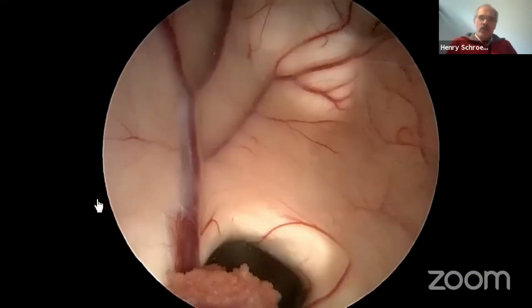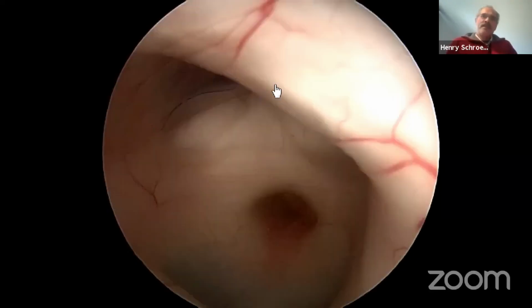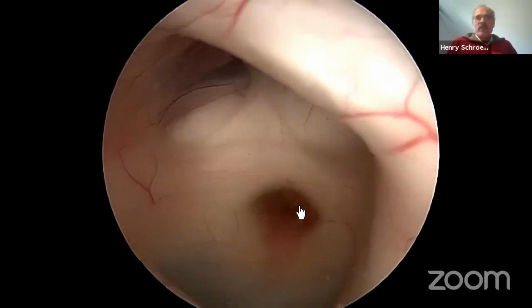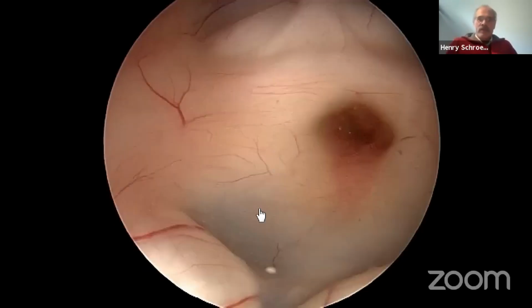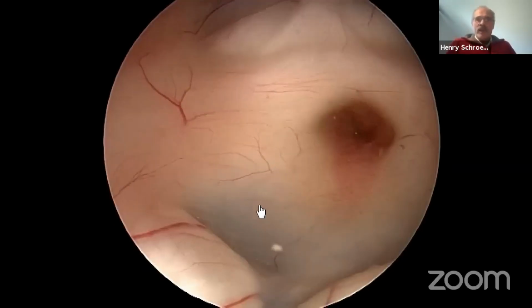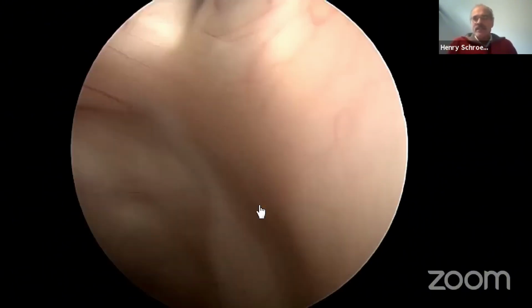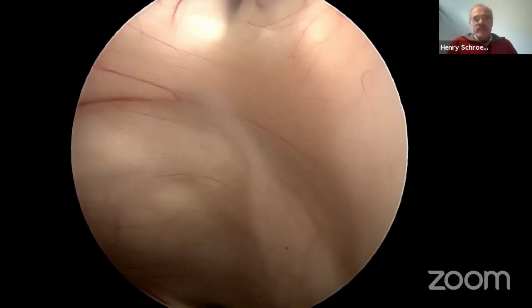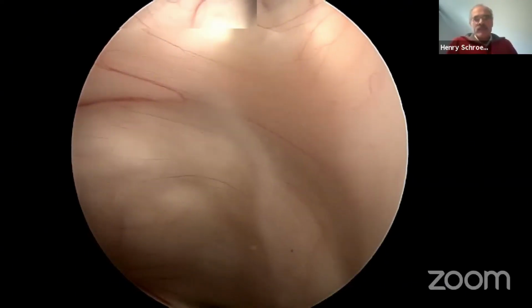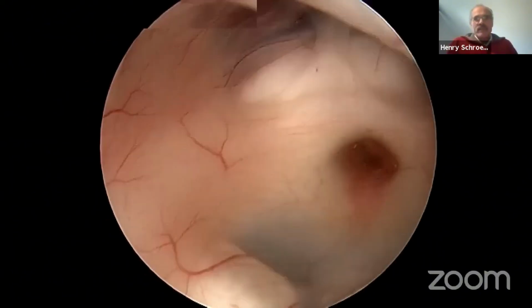And then we can go in with an endoscope into the third ventricle. You see there's a fornix here, ipsilateral, chiasm, infundibular recess, lamina terminalis with the A1, and ACOM in front. Mammillary body. So we turn now the endoscope 180 degrees, so we don't tilt it. There's no damage to the brain. Don't think that we are doing sightseeing and damaging the brain. It's just rotation of the endoscope. And you see here's the entrance into the aqueduct. And we rotate it back and remove it.